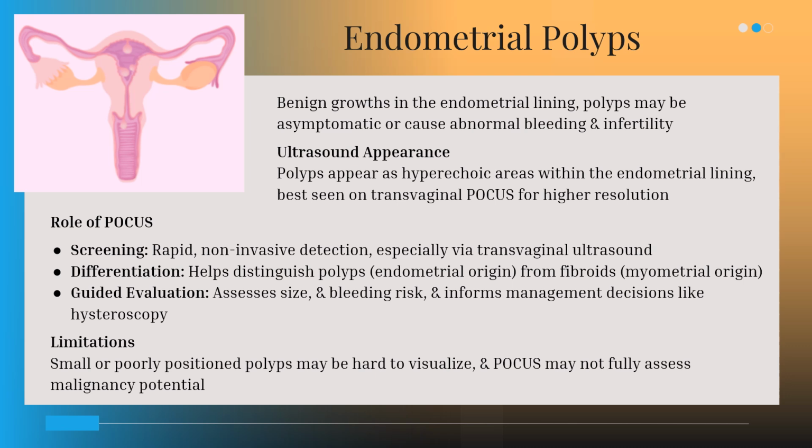But the point is you want to do just gross anomalies. As nurse practitioners and midwives and physician's assistants, we're going to be that initial gateway to get them to the obstetrician, the specialist, the person that'll do a more thorough ultrasound, or we may be that initial gateway until they can get into radiology for a formal ultrasound in a couple days.